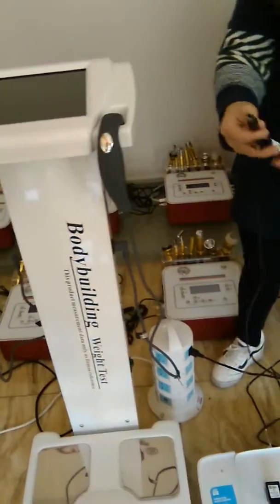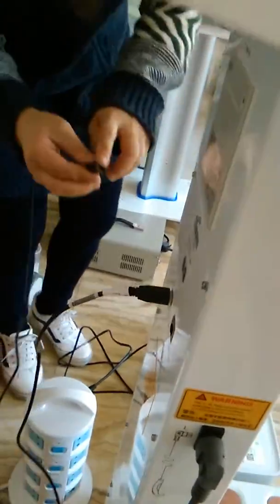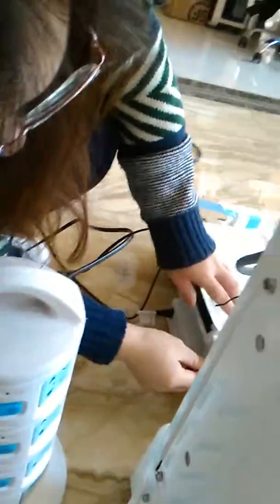And this is the line linked to — this is the USB printer line, and this goes in here.